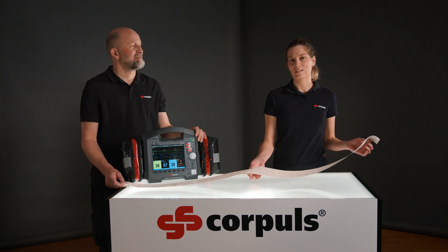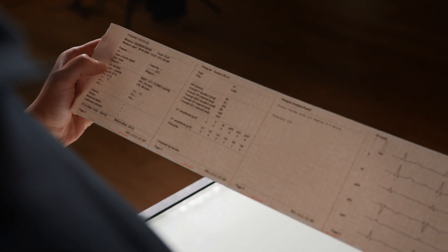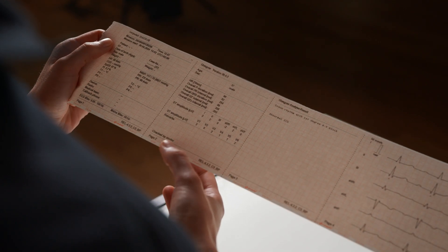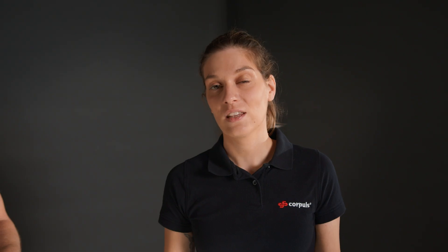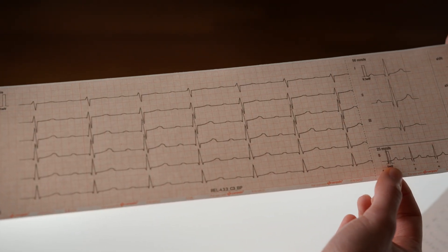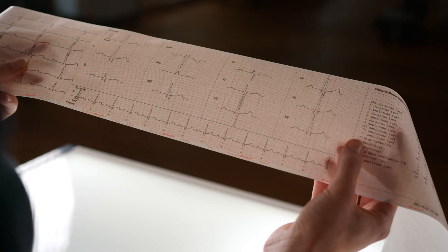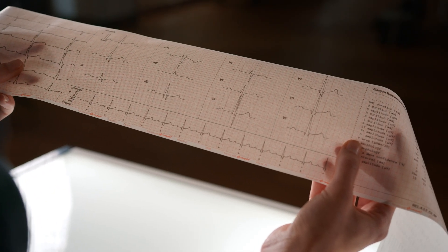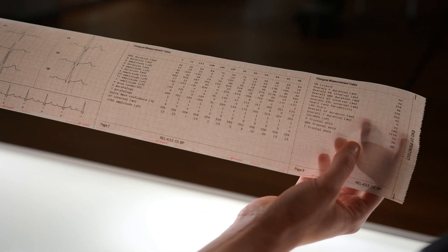We will now take a look at the printout we have created and all its components. On the far left we have the mission data and the patient's vital parameters. This is followed by the Glasgow basic interpretation and the analysis result from the algorithm. It is important that this only serves as an aid and does not replace the complete interpretation of the ECG. This is followed by the extremity leads and the chest wall leads, then the representative beat — a graphical representation of the average value of several QRS complexes. Finally, you will also find the complete Glasgow measurement table.